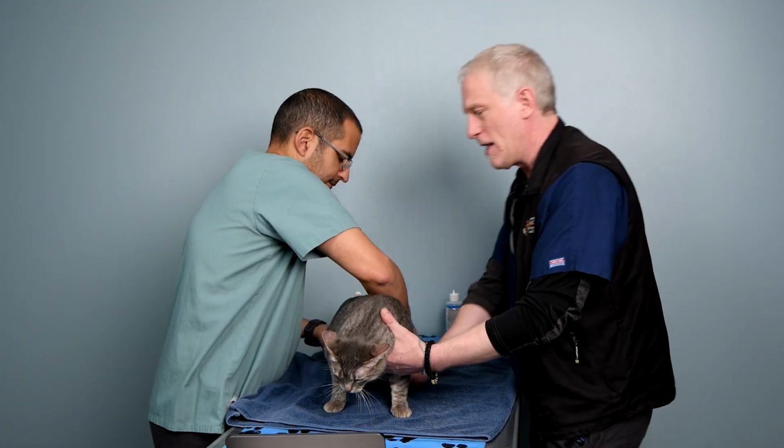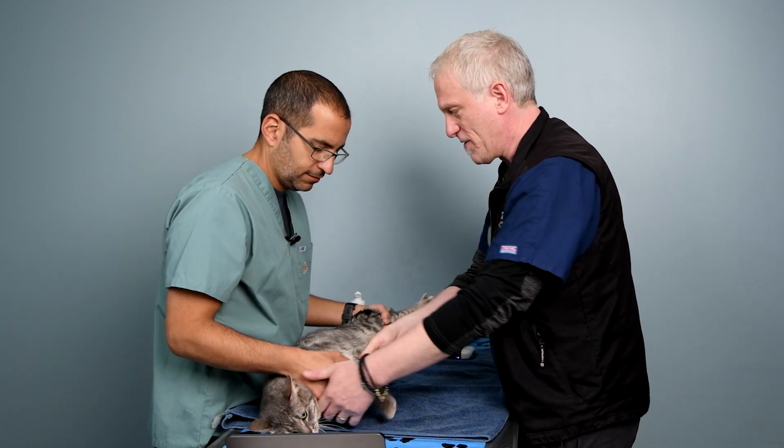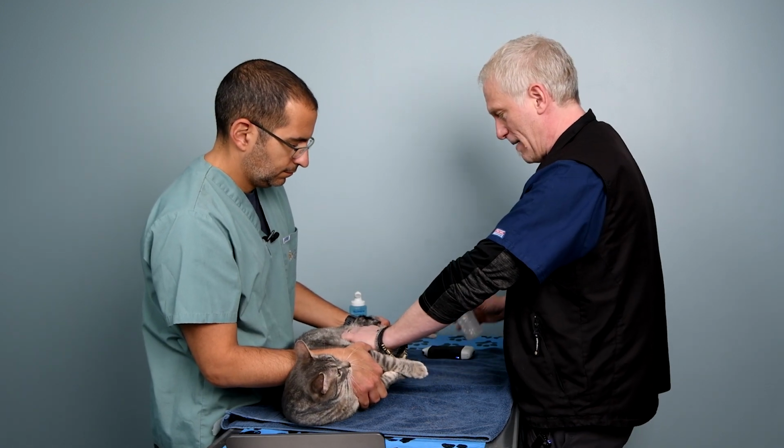All right. Now, one of the big differences between our cats and our dogs when it comes to the umbilical site, we can almost always find the spleen very easily in our canine patients, but our cats, that spleen does move a lot, so we'll just see what we have when we look at that umbilical region.